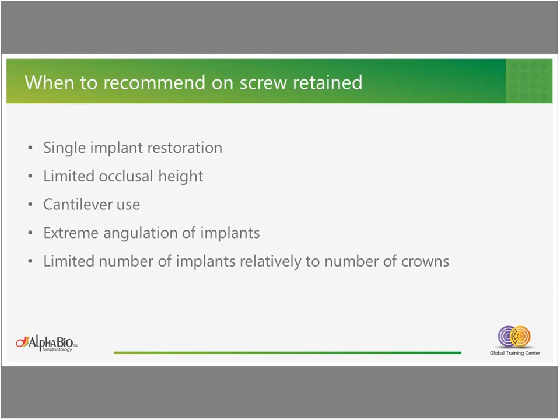And when we have a limited number of implants that also support fixed prosthetics, we need a much stronger connection, because we have much more mechanical forces on the implants and the abutments.